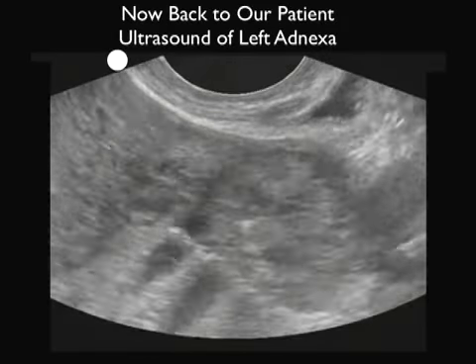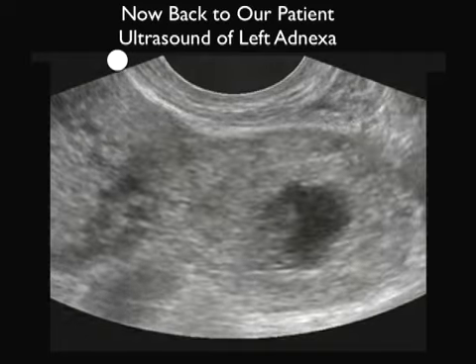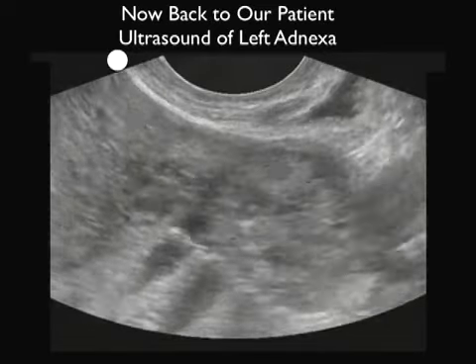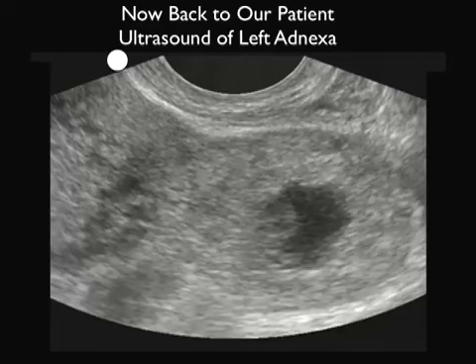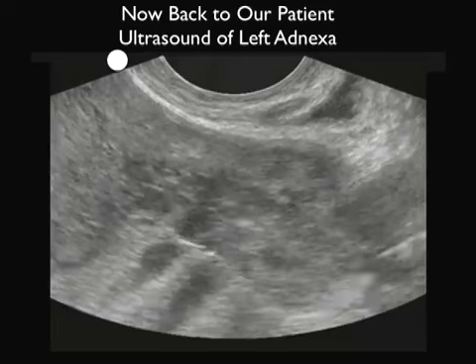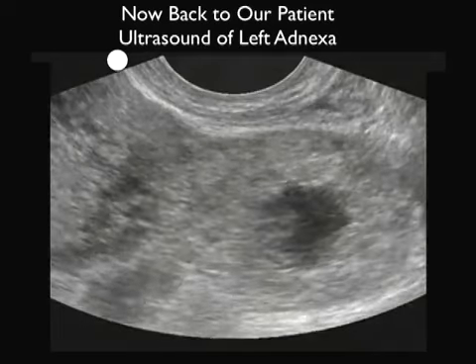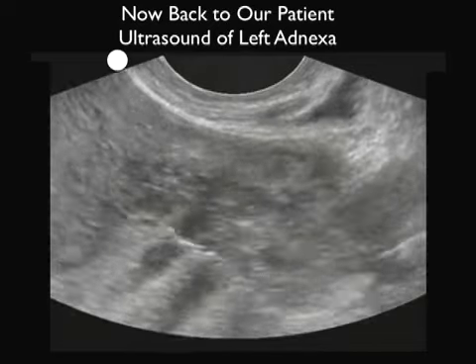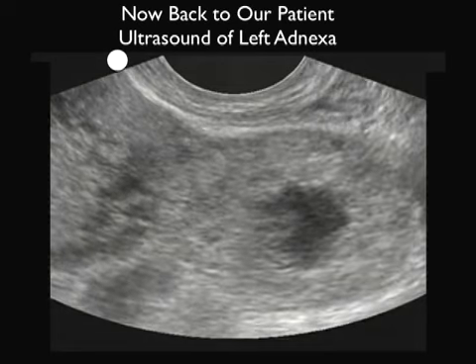So here are the sonographic findings to wrap up the conclusion of the case. Here we're scanning out from the midline uterus, as shown there, out towards the left adnexa. Notice in the left adnexa a positive finding. We see here a thickened fallopian tube, or a bagel. And let's look inside the bagel. What we see there is the presence of a fetal pole.